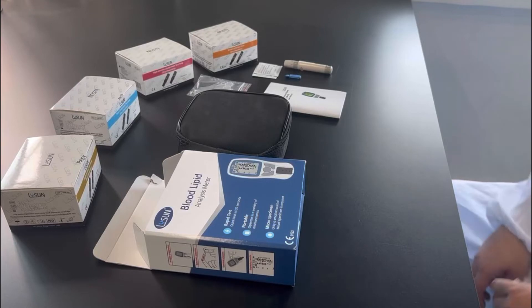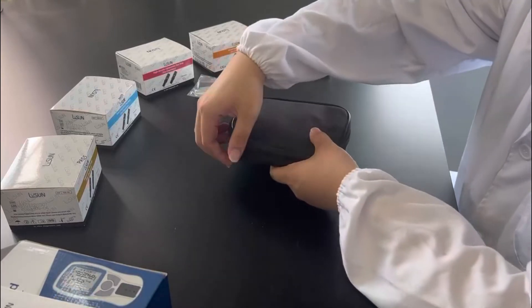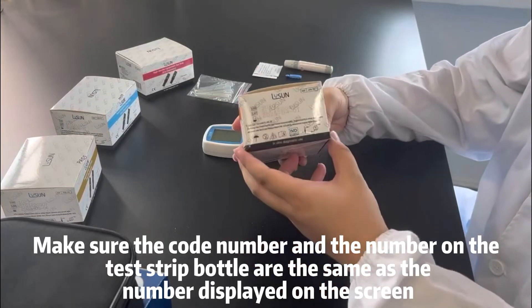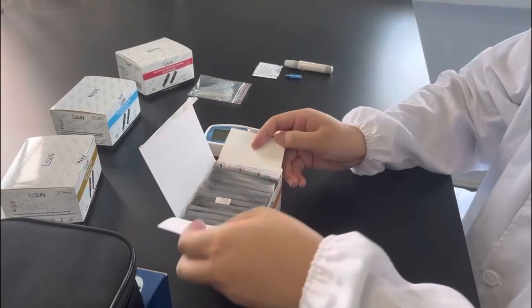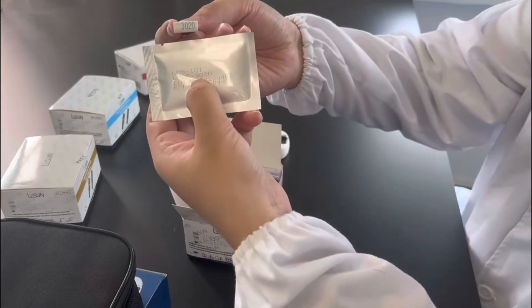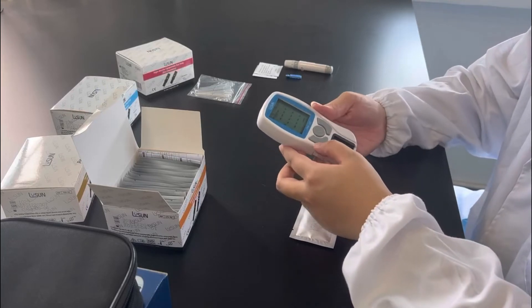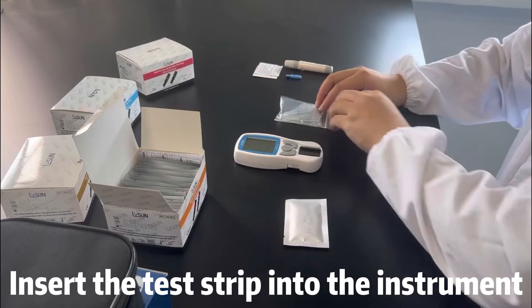Test prepare. Make sure the code number and the number on the test strip bottle are the same as the number displayed on the screen. Insert the test strip into the instrument.